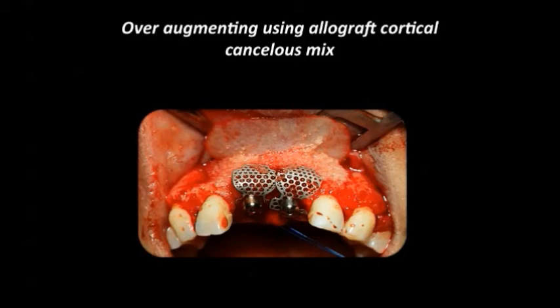As we discussed before, we over augment because we had extra allograft material, mixed with the patient's blood, and then you can see it's all placed to over augment the area, extended more to the apical side to try to correct the defect.